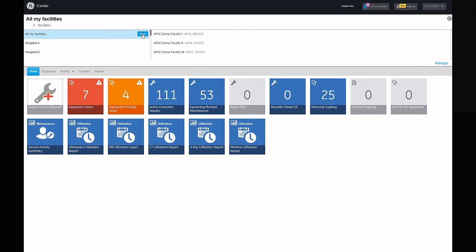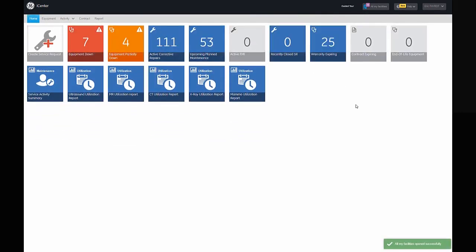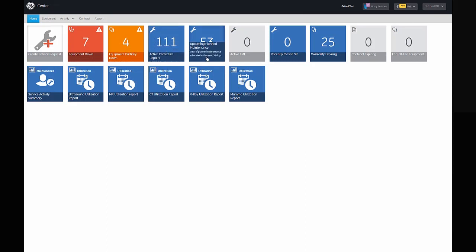By clicking 'Open in All My Facilities,' you will see a series of tiles on the iCenter page that provide you with an overview and quick access to ongoing service activities. You can also access utilization reports for your connected imaging equipment.